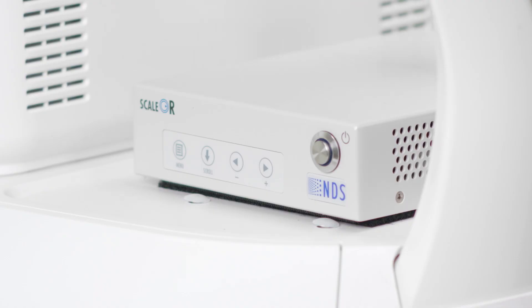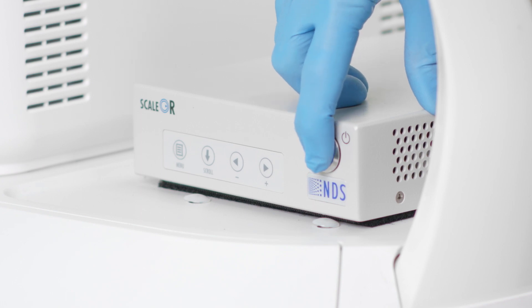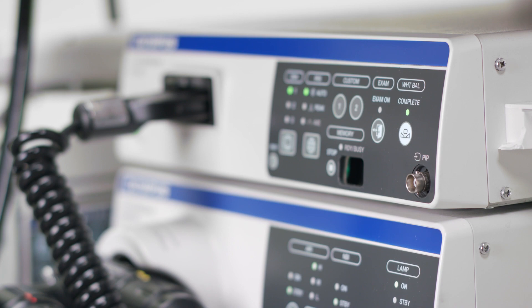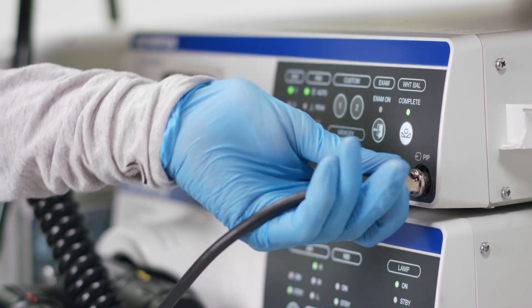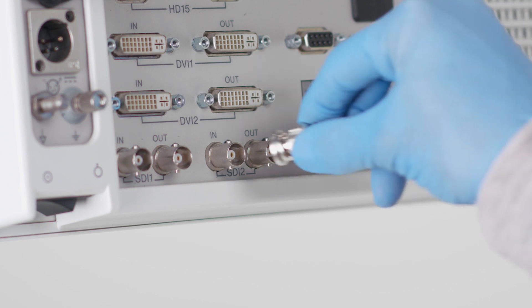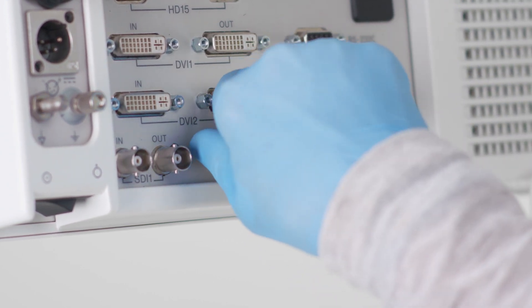If the sub-screen is still gray after flipping through all of the input options and you are using the SDI output from the Arrieta 850, check that the converter box on the back of the Arrieta 850 is on. If you are not using the SDI output, but rather composite, make sure that the cable is connected to the front of the CV190 and not the back. If the sub-screen is still gray, check the cable on another monitor. The cable may be damaged.